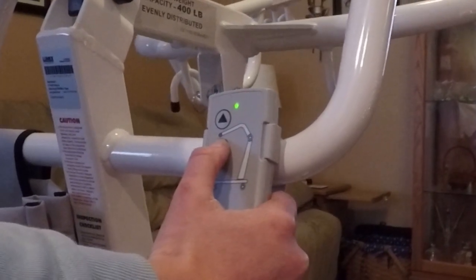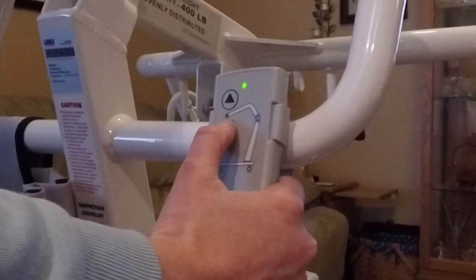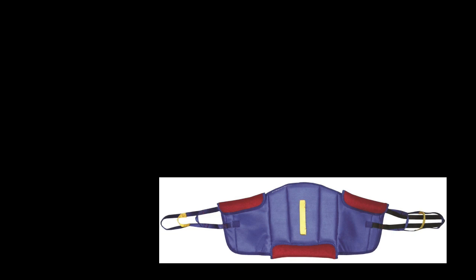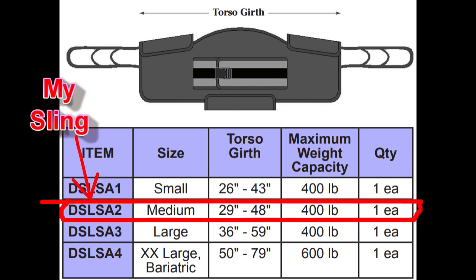My sit-to-stand has a corded pendant to operate the up and down direction of the lift. But before jumping the gun, let's discuss a little about the sling used with this type of lift. Make sure you select the correct size of sling for the person being lifted. Every sling manufacturer has its own size designations that should be referenced when selecting a sling.